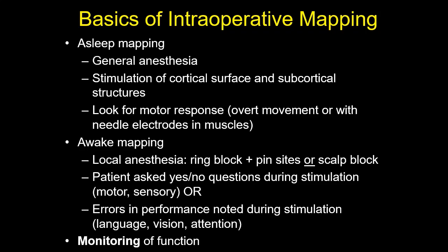An important adjunct to intraoperative mapping is monitoring of function, where we continuously evaluate the patient's performance even when not directly stimulating.